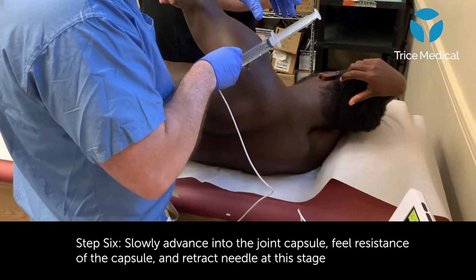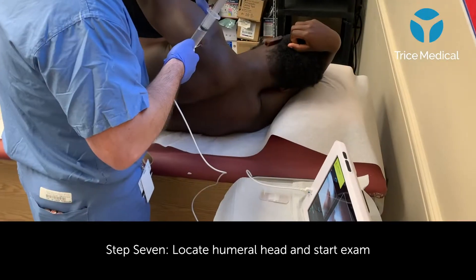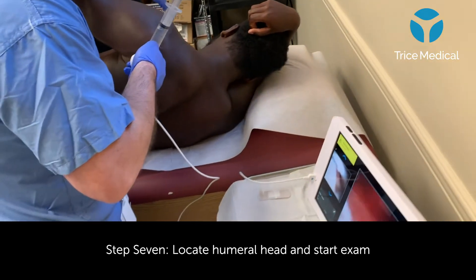Once I've accessed the local area, I will use sterile saline for injection. A thorough evaluation is undertaken and the site of pathology is localized.